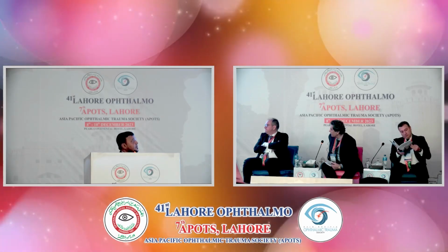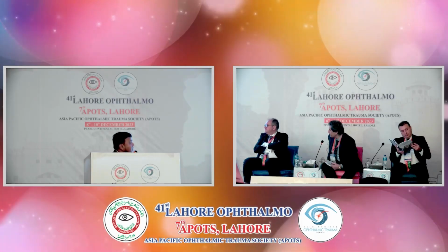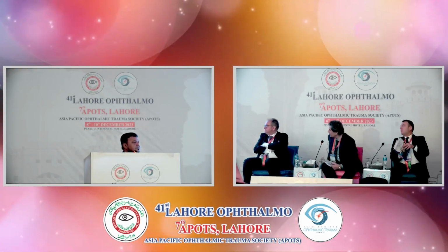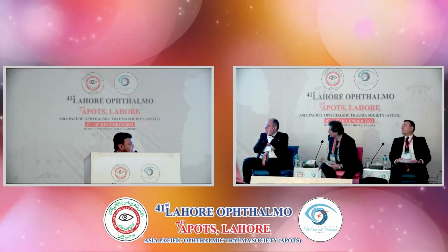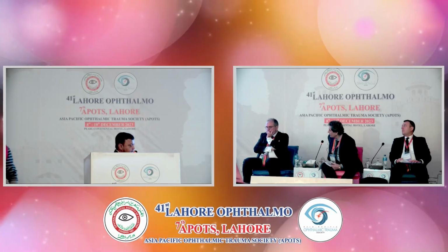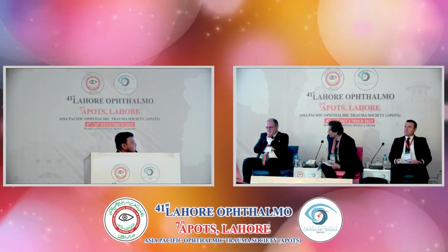Because I tried both the options in this case because the patient was only eyed and she needed vision, and you see the result. What is the logic of giving a relaxing incision? What does it do? So relaxing incisions are just like we do the Z-plasty in oculoplasty, and it approximates, and because the break was very large, if you do the relaxing incision, it reapproximates easily and does not cause contracture of the margins of the wound. Okay, thank you very much.